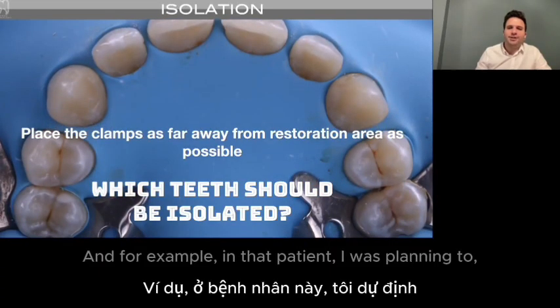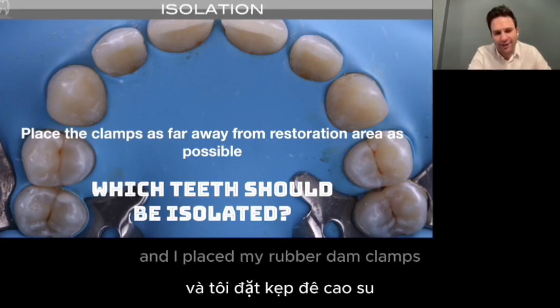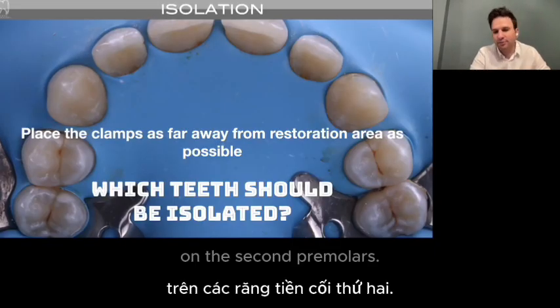For example, in that patient, I was planning polydiastema restorations from canine to canine, and I placed my rubber dam clamps on the second premolars.